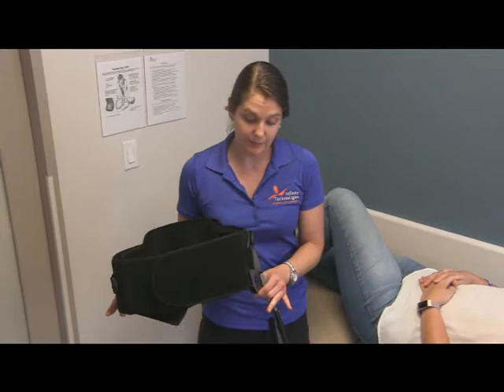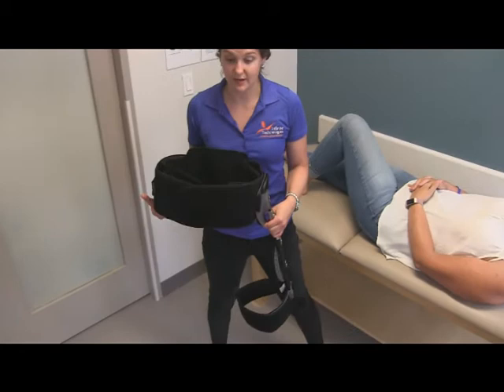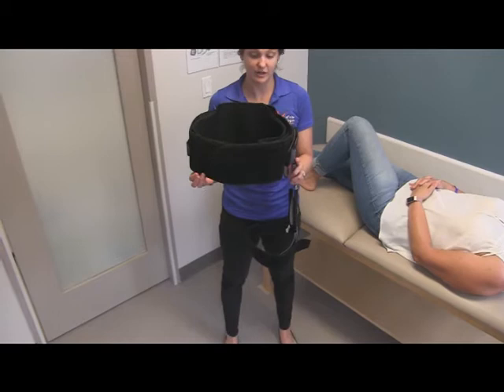Today we are going to be fitting a hip abduction brace on our patient. The hip abduction brace is meant to keep the hip abducted, meaning it's going to keep your hip out to the side. This brace is set up for our patient's left hip to protect the left hip from potential dislocation.